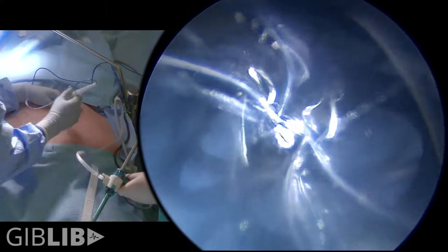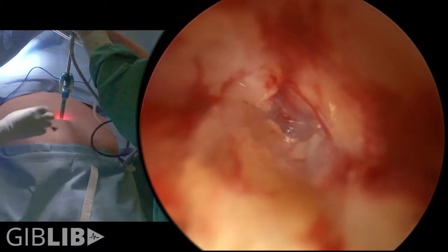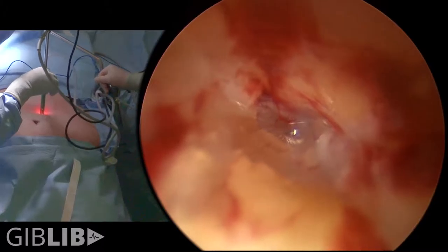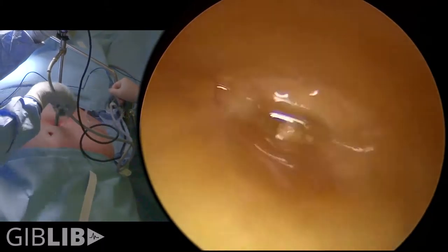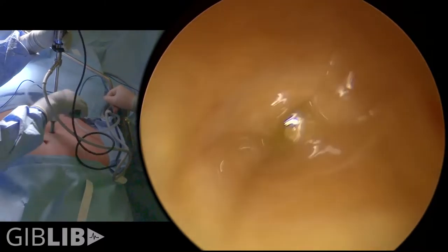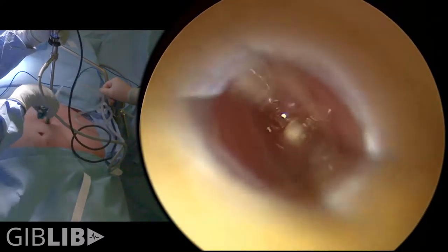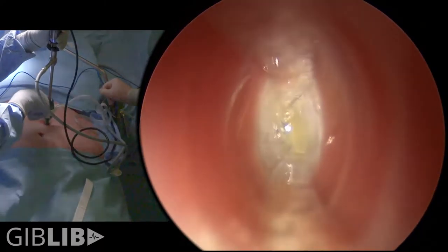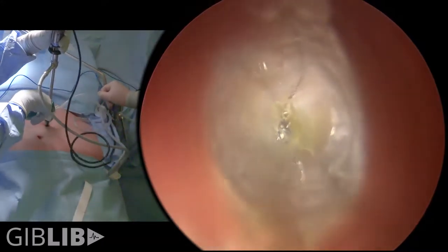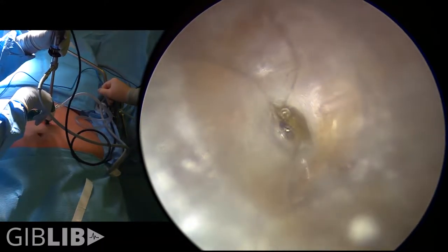This case is a sleeve gastrectomy and our first entry is going to be an optical port entry. We keep the gas on low flow because this port has a small hole at the tip of it. It allows us to go through the anterior sheath, rectus muscle, and now posterior sheath. The insufflation is going at low flow the whole time so we don't have to use a Veress needle.